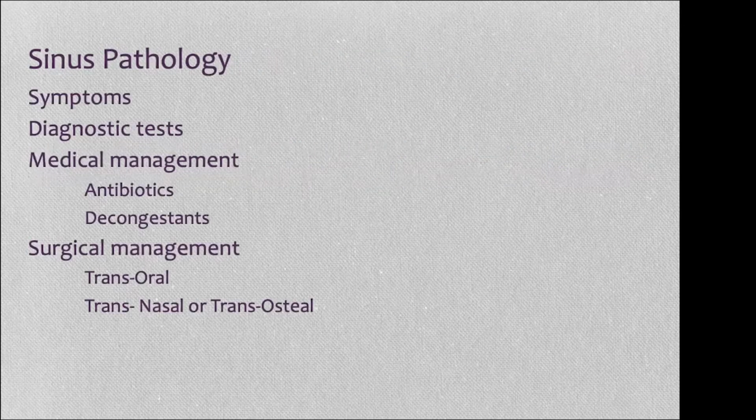And so also we must look out for sinus pathology, because you may have a lot of bone. You may need to do just about 3 or 4 millimeters of a sinus lift, and yet you have significant pathology. Things like sinusitis, even rhinitis, allergic or infective or viral rhinitis. You may not want to approach the sinus because the mucosa, when inflamed, becomes very friable, and a procedure that would have been minimally invasive can cause complications.